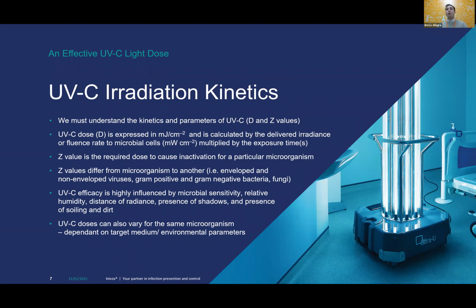On top of that, something that we've been seeing more and more is that there are several other parameters that also contribute to what the Z value will be. These are the distance, obviously, of your unit to the surfaces or to the decontamination target, whether or not there are shadows present, and the presence of soiling and dirt.